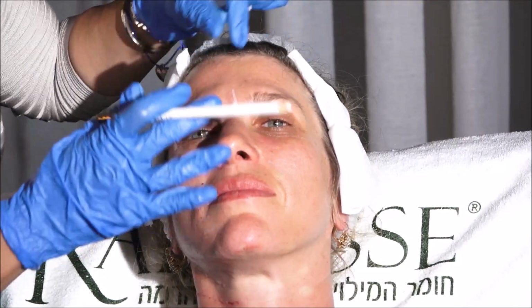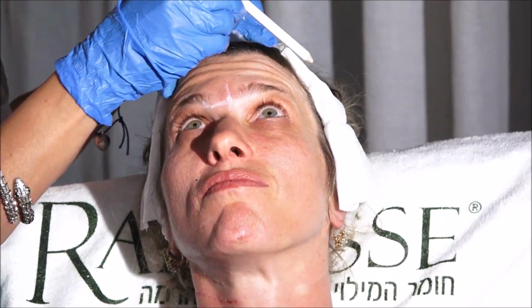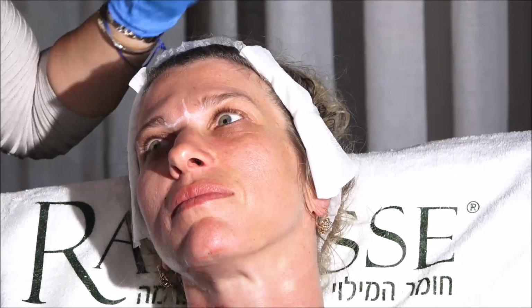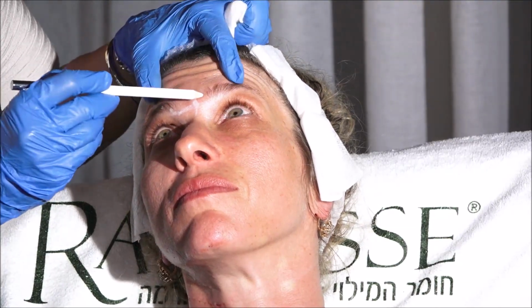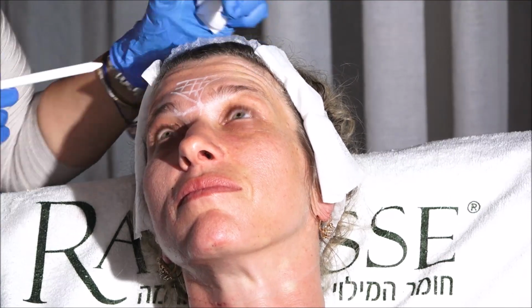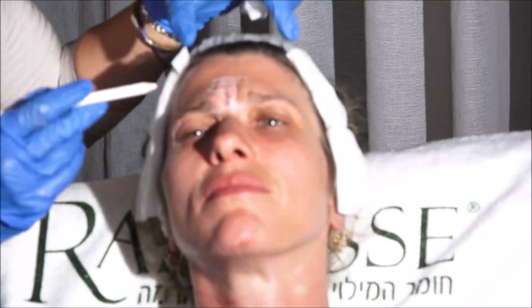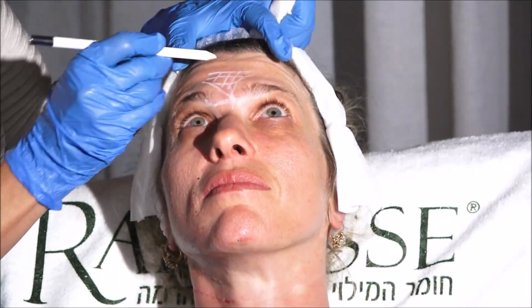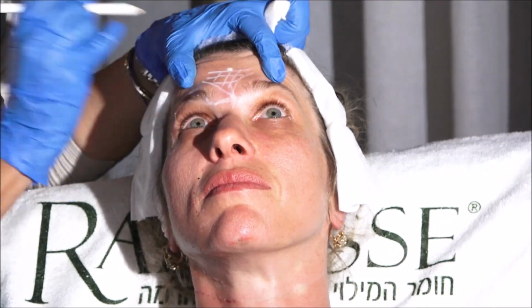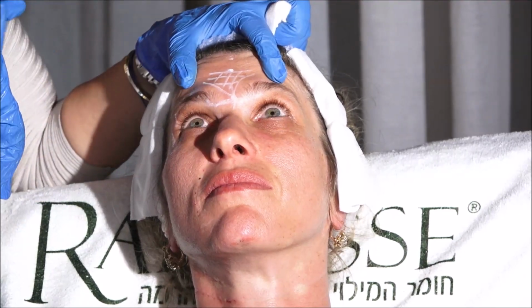For the forehead, elevate the forehead? No, elevate, yes. So she has the aponeurosis, contract, here. She doesn't have any contraction. So I don't do anything in this center, but I do upper, so contract, no, up, yeah. So I start in the first wrinkle, then 2 centimeters up, remember 2.